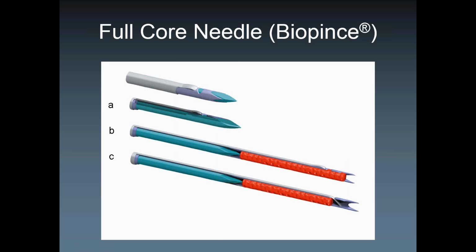Now, how are you going to hold the cylinder of tissue within the device without it being stuck at the host tissue and being left in there? There's another blade running on the outer surface of that full core device, and within one click, the first thing that happens is that this whole device runs into the patient, and at the same time, without you noticing, this little blade is going to run through that notch here, and it's going to snip off the tissue and hold it securely in place.